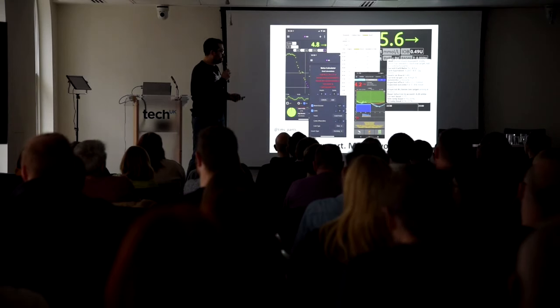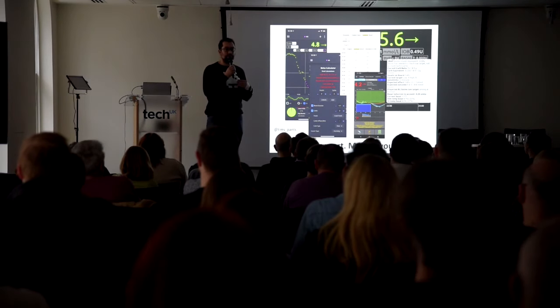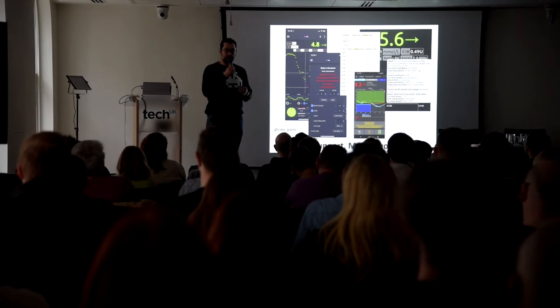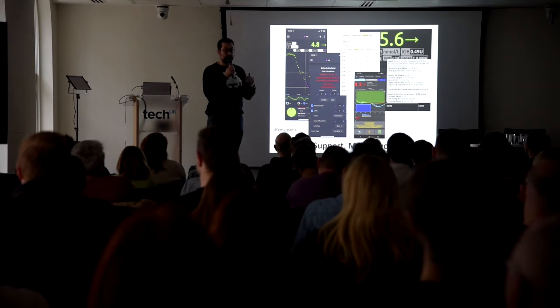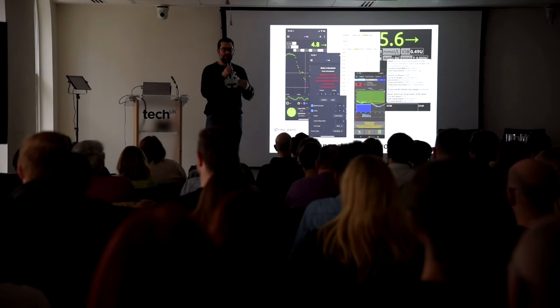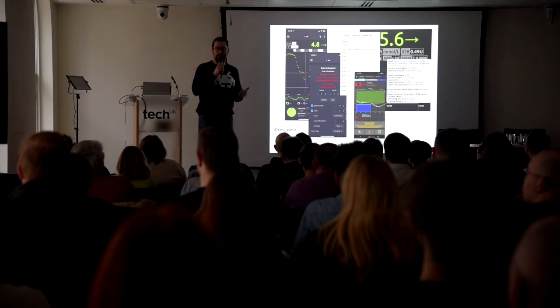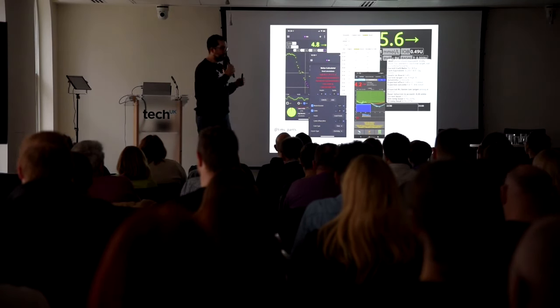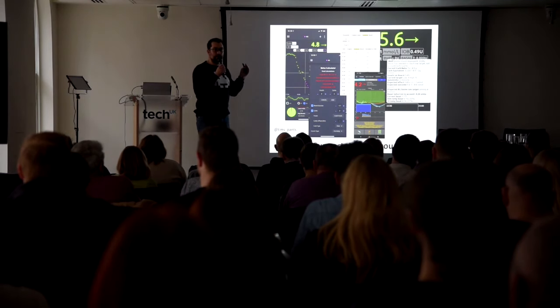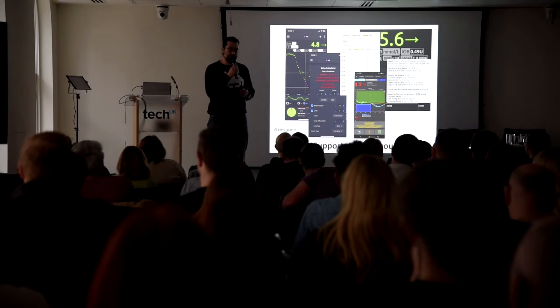In addition, you've got the open loop tools within Android APS. So you can use Android APS with a virtual pump if you have a pump that isn't compatible, and it will tell you when it thinks you need to adjust basal rates in order to deal with highs or lows. These are all ways of interacting with your diabetes, but without having to have it run as an algorithm in the closed loop position. And that is what some people want. Some people don't want to go fully closed loop. This makes it available to pretty much anybody, because you can use these decision support tools with MDI. So you don't need to have a pump to do that, and that opens them up to anybody who is interested in looking further into these things.